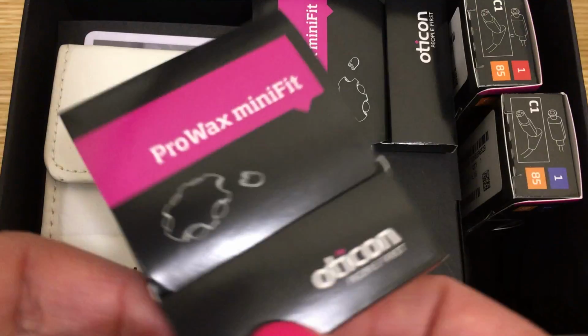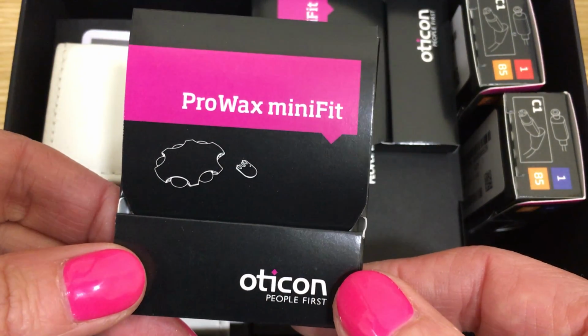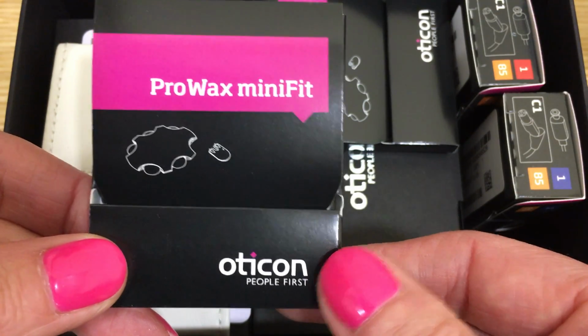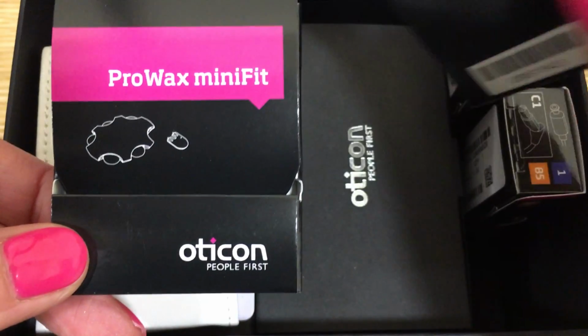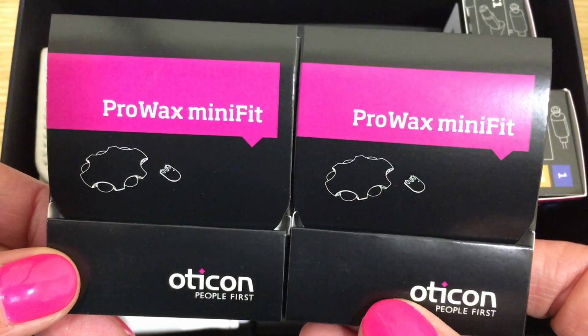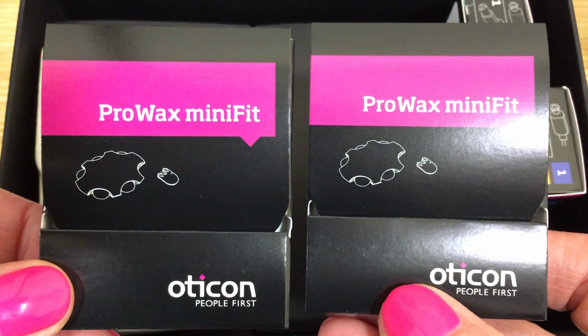Now here we have the Pro Wax Mini Fit. Oticon do two sizes of wax filter, and we have the smaller wax filter, the Mini Fit, for the receiver in the ear range.